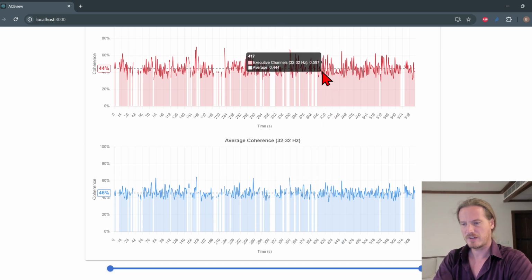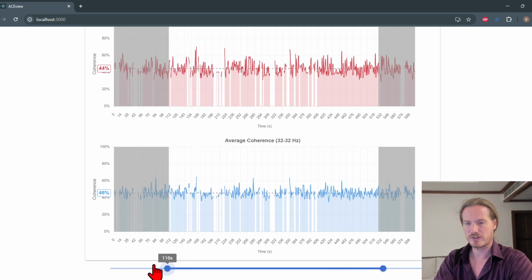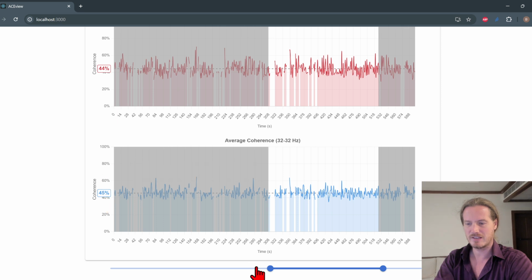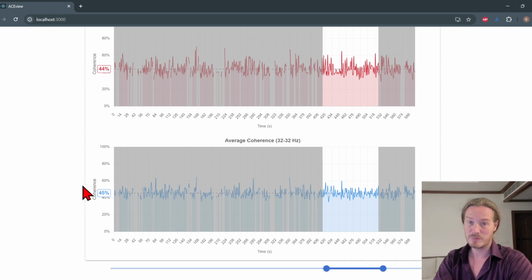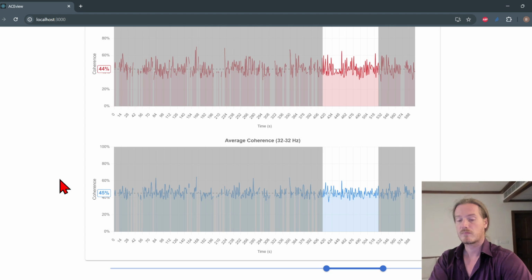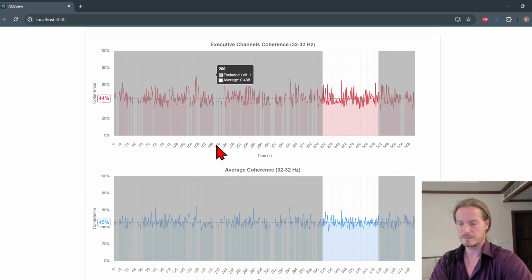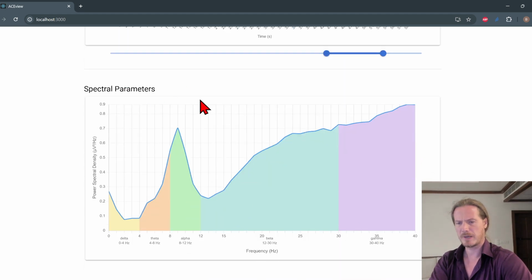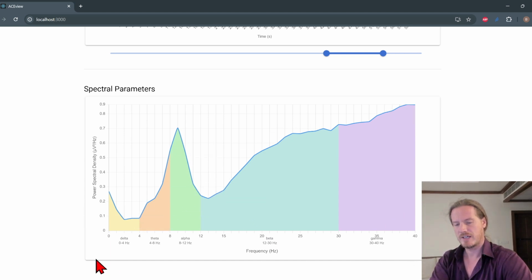If for whatever reason I only want to see this part of the range here, then I can actually change the slider here. And as I'm moving the slider, you will see that these numbers slightly vary. They don't vary that much because, well, this guy is pretty steady. And most people are very steady, actually. But so we can really zoom into a single little part of their recording. And then there's the spectral parameters chart, and it shows us now the x-axis is not time, so this is not time domain, this is what is called frequency domain.